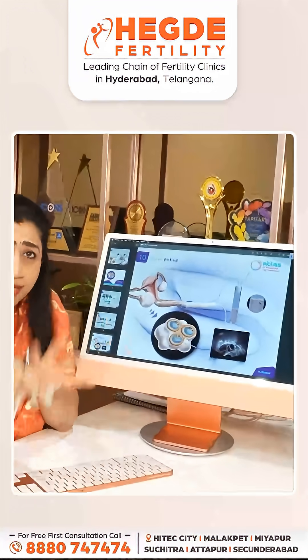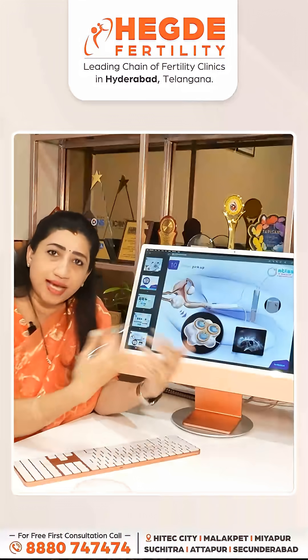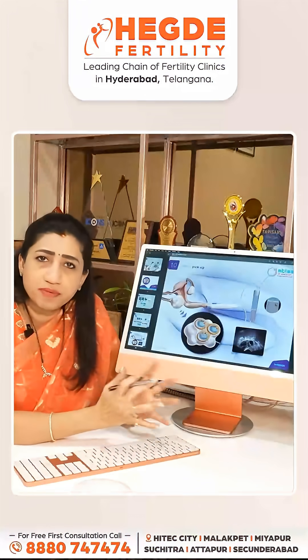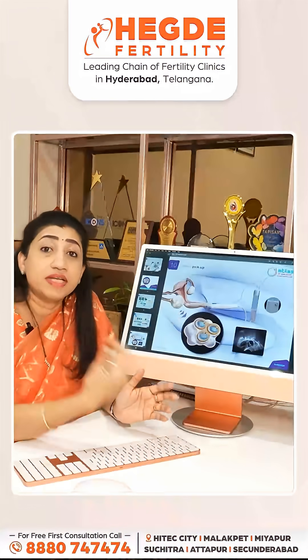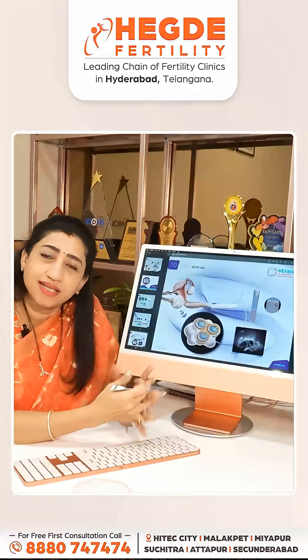These eggs are then separated out and kept in the culture dish. This entire process — right ovary and left ovary aspiration — usually takes 40 to 45 minutes to complete. Once the procedure is completed, the patient will recover from anesthesia, usually within one or two hours, and they can go home.